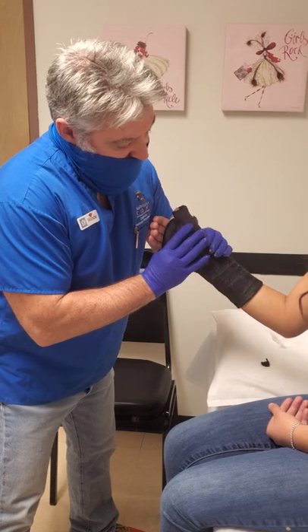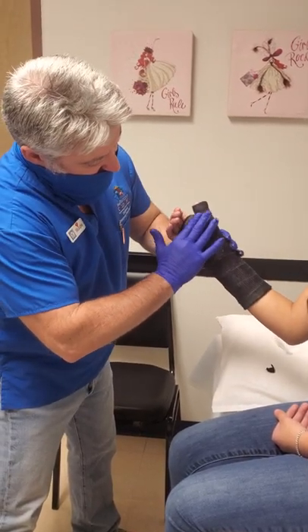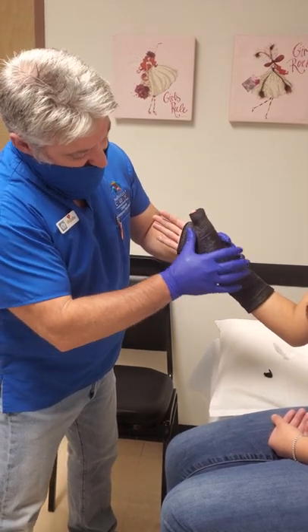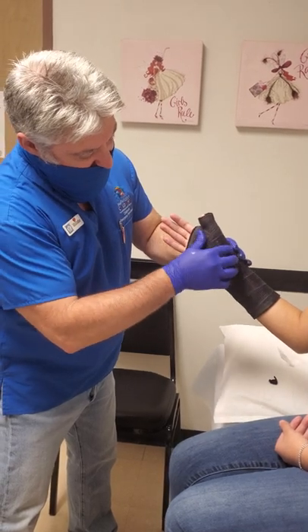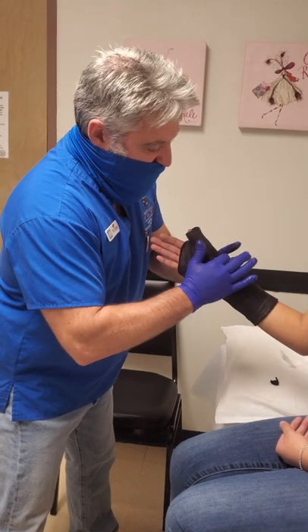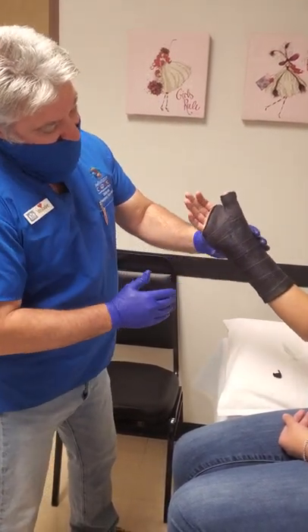And you do your final shaping. That is your nice thumb spica — soft edges so she can use her hand to do things. There's a little natural crease in the palm of the hand so she can still use her hand to grab things, and a nice natural little bend where the wrist would be. And that is your thumb spica.